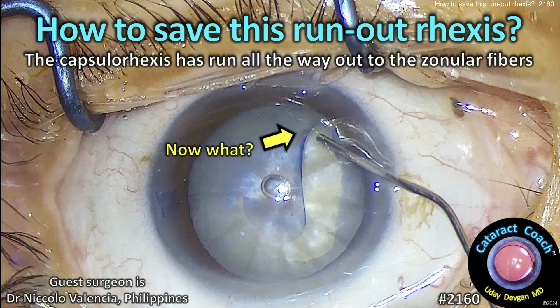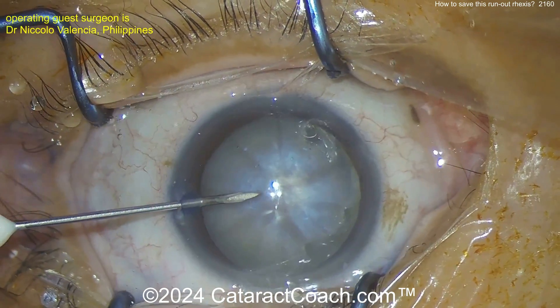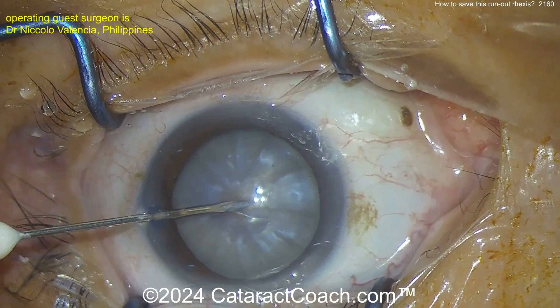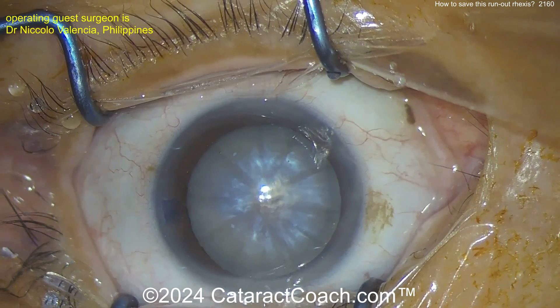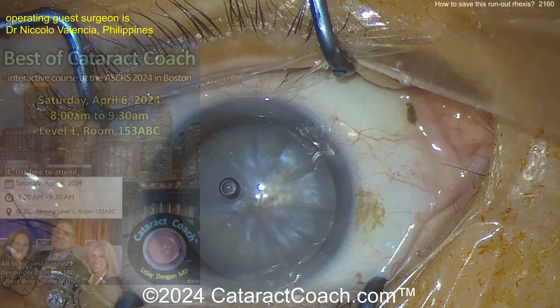CataractCoach.com. How to save this run-out capsulorrhexis — it ran all the way out to the zonular fibers. This is a tough case. It's already been stained with trypan blue dye. Going in for some needle decompression through the paracentesis, and I like to rock the nucleus a little bit. Decompress the capsule back — that's going to decrease the risk of the Argentinian flag sign, but obviously not eliminate it.